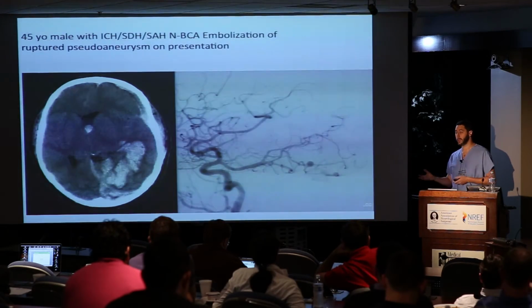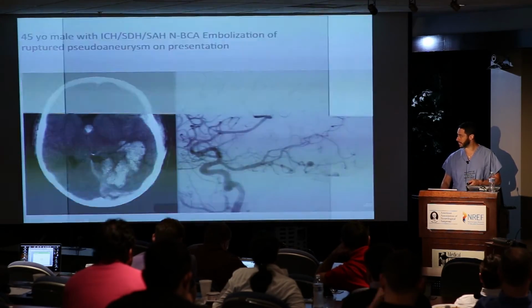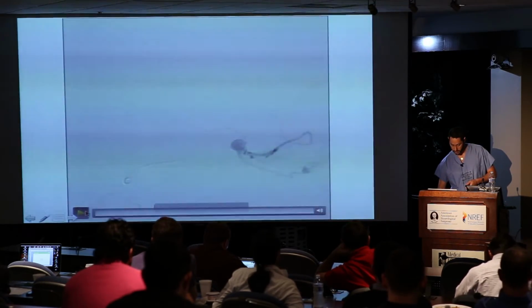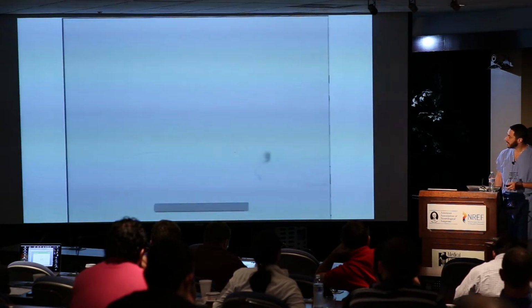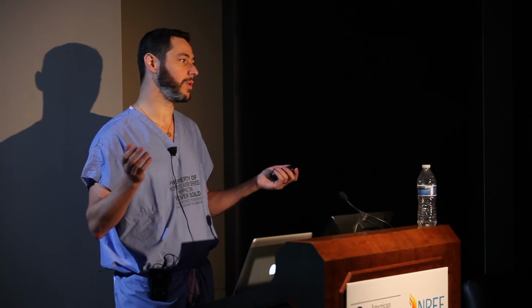So, how are you going to fix this? What is the technique in this situation? So again, microangiography, very important. You're working your way there. You can see that pseudoaneurysm, but you can also see some normal blood vessels. And personally, I think you can inject an embolic from here. He's had a bad injury. You probably won't know.